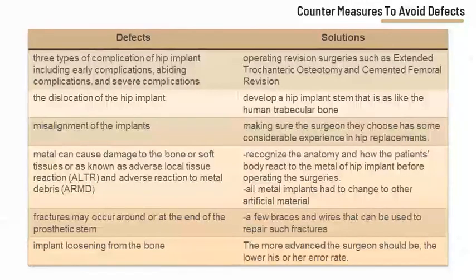Third, the defects or fracture may occur around or at the end of the prosthetic stem. A few braces and wires can be used to repair such fractures.